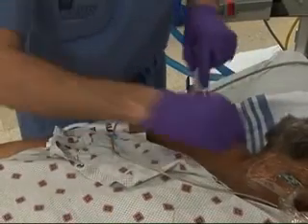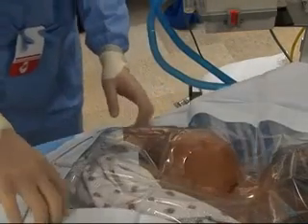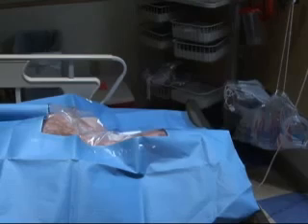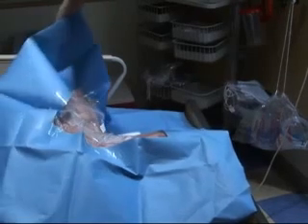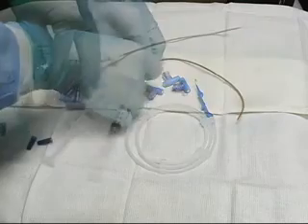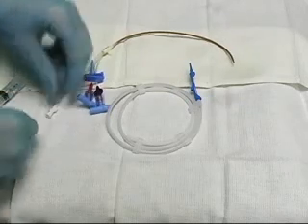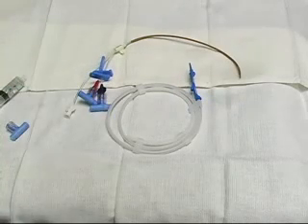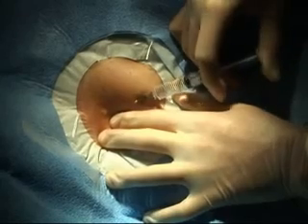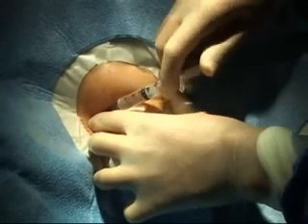Prepare the area by scrubbing the skin with chlorhexidine for 60 seconds and drape the site, being sure to include all landmarks within the sterile field. If the patient is conscious, explain that his or her face will be covered but that breathing will not be obstructed and that he or she can signal for attention by raising a hand. Flush the lumens of the central line with saline or heparin and ensure that the guide wire threads easily through your needle. Remove the cap from the port through which the guide wire will be threaded, commonly the longer lumen. In a patient who is awake or minimally sedated, the skin should be infiltrated with a local anesthetic such as 1% lidocaine with a 25 gauge needle to help minimize pain on insertion of the catheter.